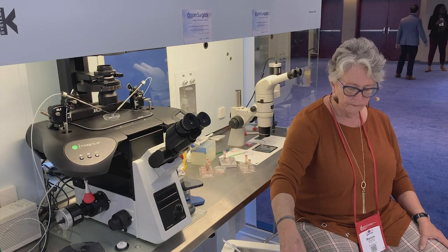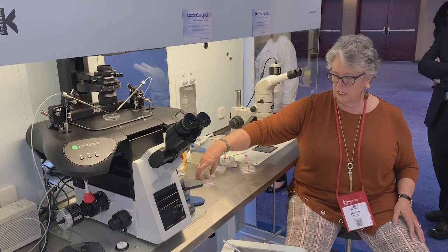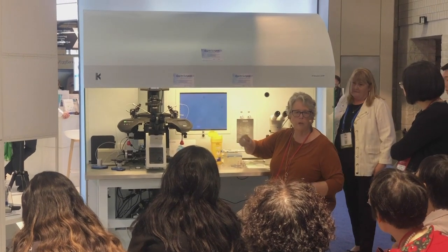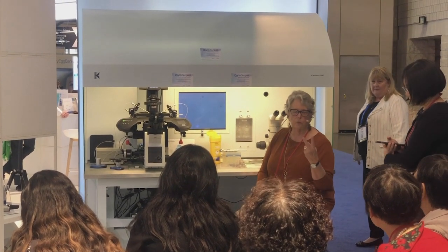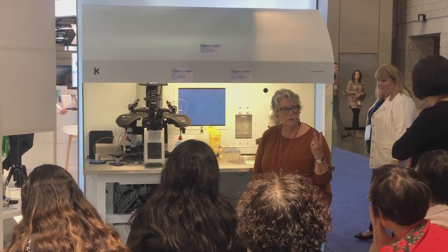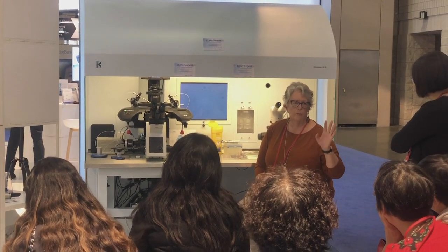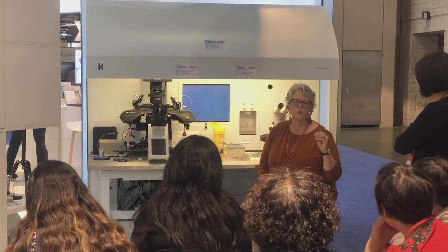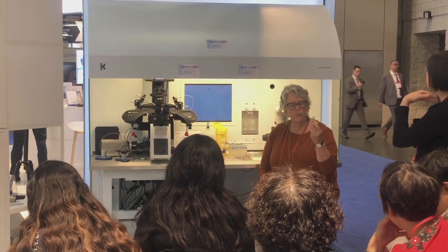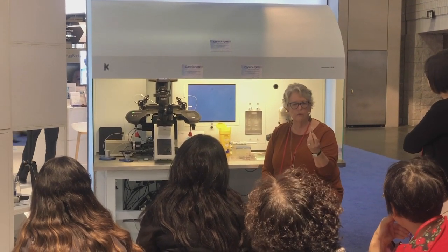So now let's talk a little bit about warming. With the kits, we take out the first solution. Let's say we know we're going to warm two embryos. It depends on my lab. Sometimes we'll put maybe two embryos on a device if we haven't done PGTA on them. But in many of my labs, we're doing 100% PGTA these days or pretty close to it, so we're pretty routinely doing one embryo per device. So we put one tube in the incubator per device that we're going to thaw.